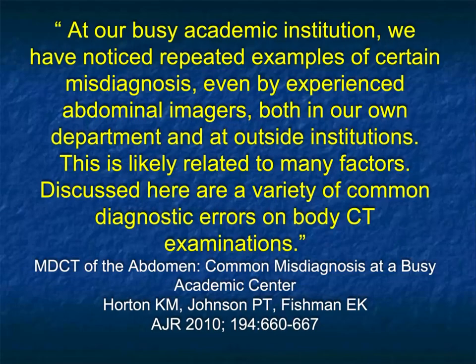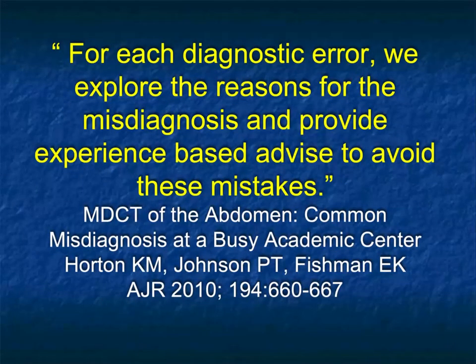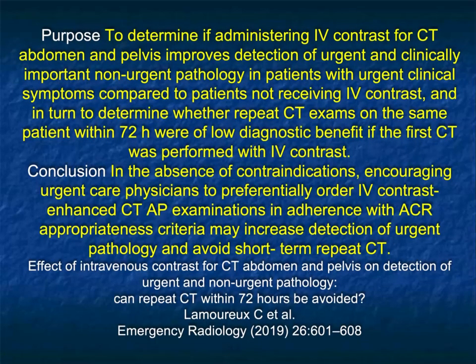Now, we took a different approach perhaps, and this is going back more than a decade, where we recognized in our own practice that although there are an infinite number of errors possible, there are certain errors that happen over and over again. If you just thought for a second, what's a common error? One is to miss a PE. That's a common error. Two, to miss an early pancreatic cancer. That's a common error. So we thought perhaps if you look at the common errors and explore why those errors happen and you think about them, you're probably going to make them less frequently. So that is a good way of thinking about things.